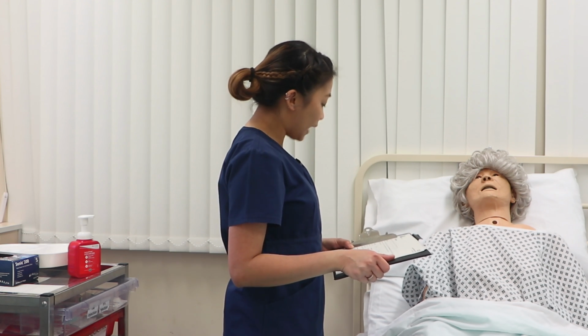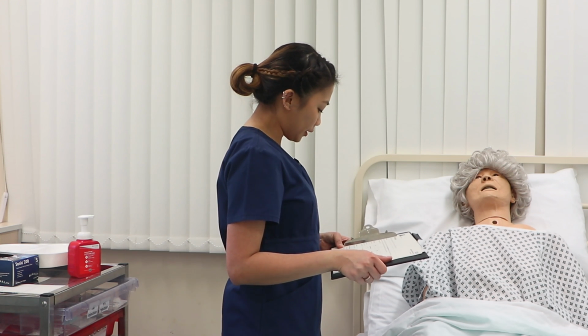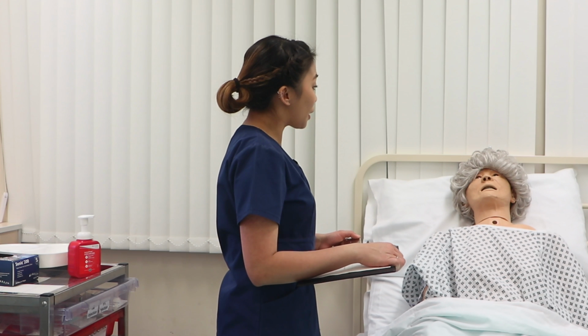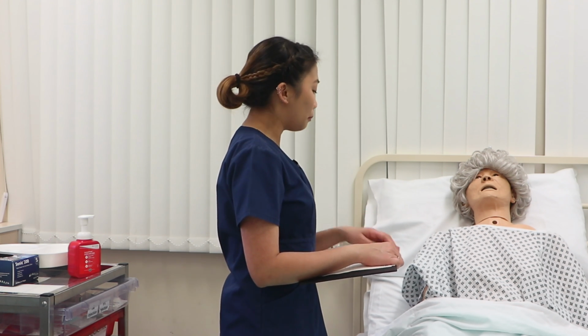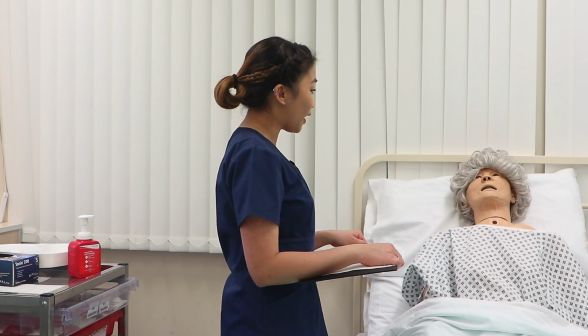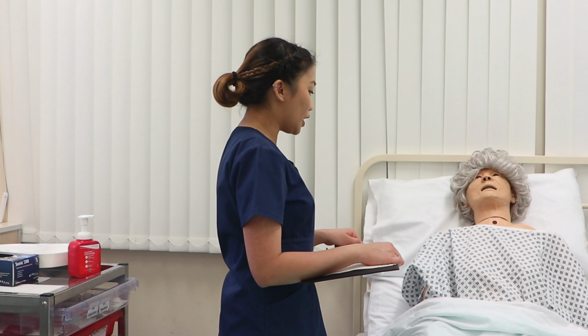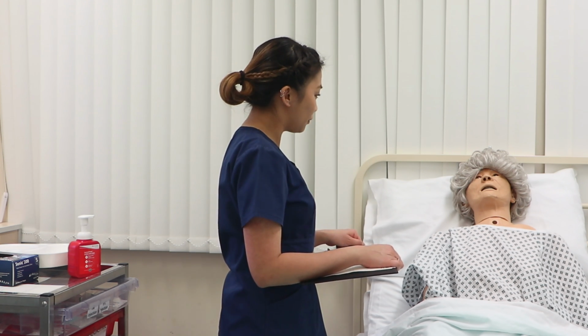And have you got any allergies at all? Alright, it's also noted in your notes. Alright, Emma, I am here today to do an intramuscular injection. So this procedure involves a needle, but don't worry, I will be gentle as possible. Alright, because I'm giving you a medication via intramuscular injection. It is a hydroxycobalamin. Have you had one before?